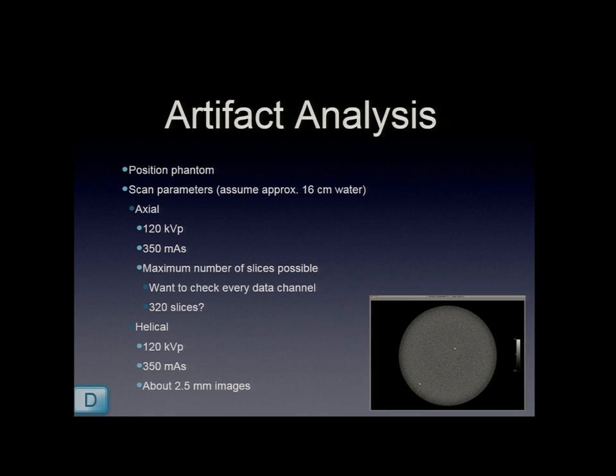I've done it on several occasions, and it's really easy to get kind of a "I don't think this is necessary" mentality if you do that many slices, because you don't really see anything. You usually see it somewhere else rather than that. But you can really scroll through them rather quickly, and things will jump out if you're used to seeing these images.